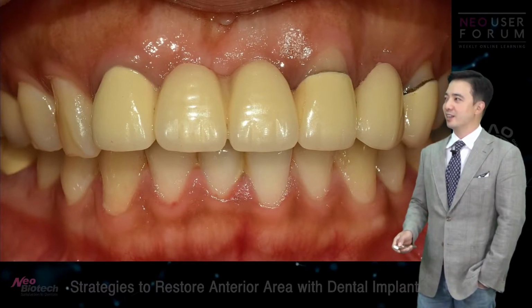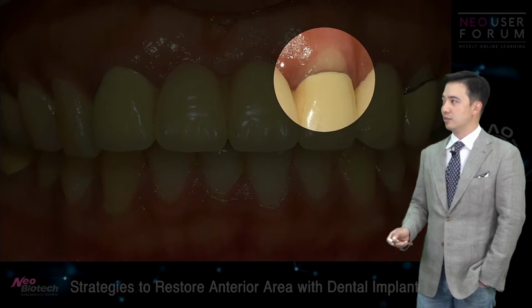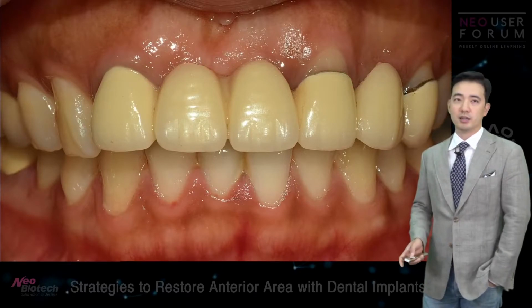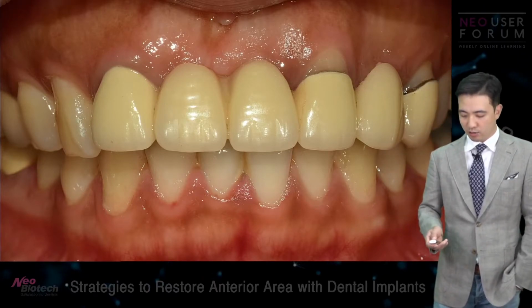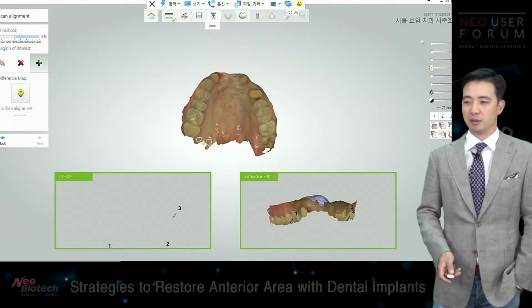And as you look here, there's a marked recession on the number 22 area. I thought I already knew this was going to be a challenge, but I just took the bullet and said, okay, let's do this. I'll try my best, and we can make this happen.